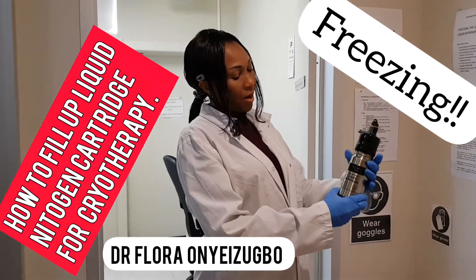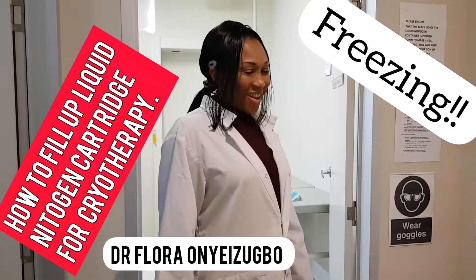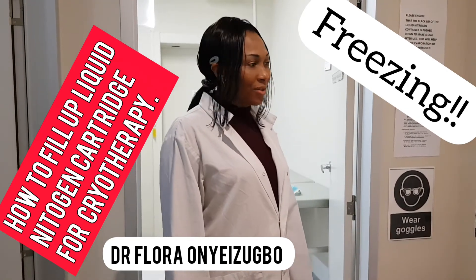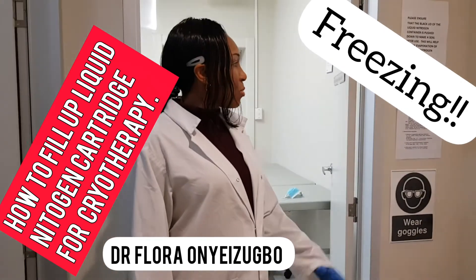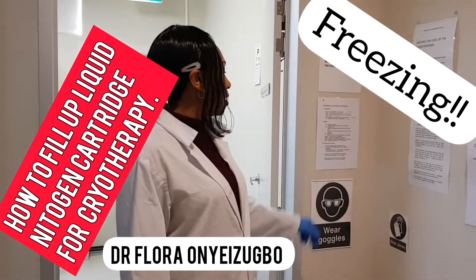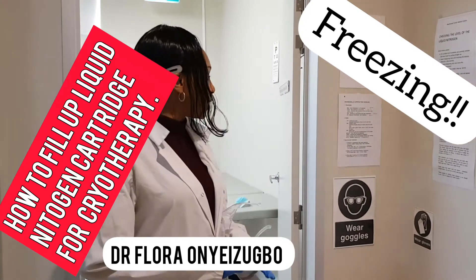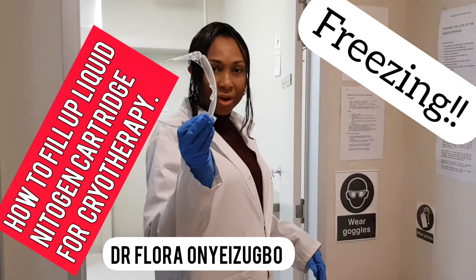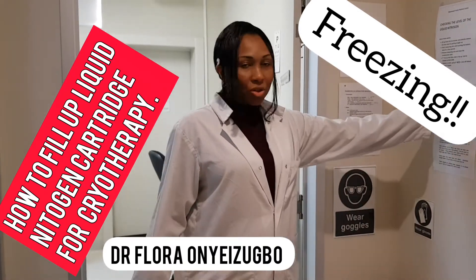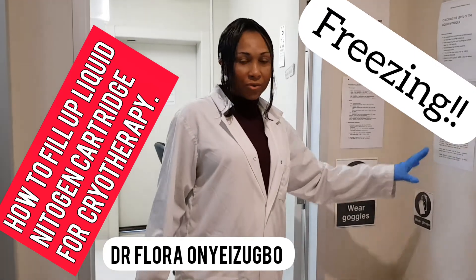This is the cryobottle and this is the cup. Now it's time to fill up the liquid nitrogen. In most clinics, you would have instructions on safety measures for filling up liquid nitrogen, because it's a gas and it can be dangerous if it gets into certain parts of the body. One of them is wearing your goggles, wearing your gloves, and also reading any instructions on the wall.